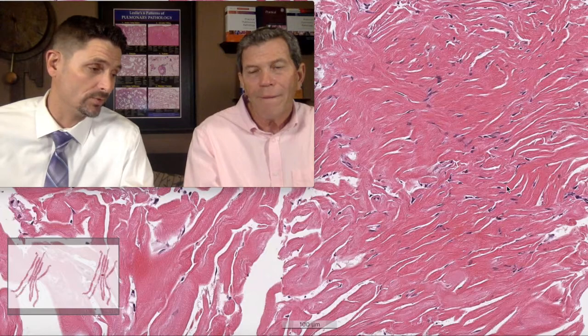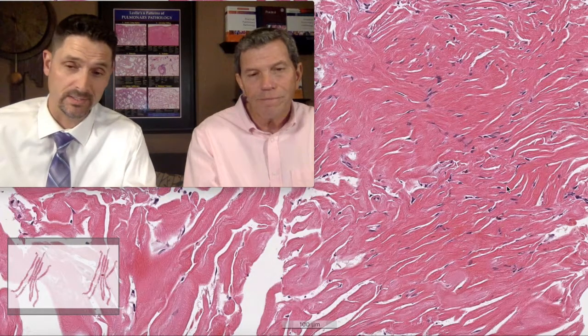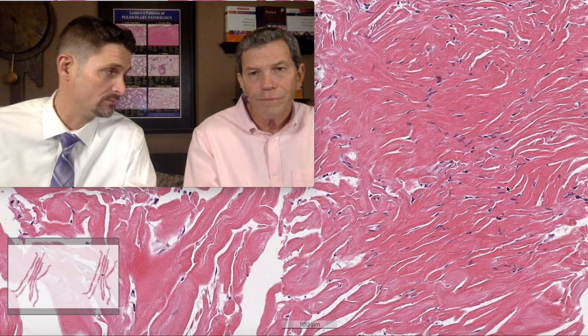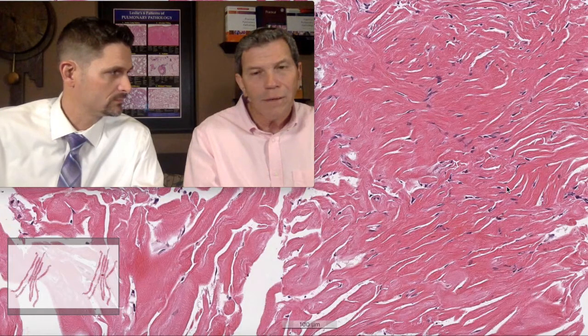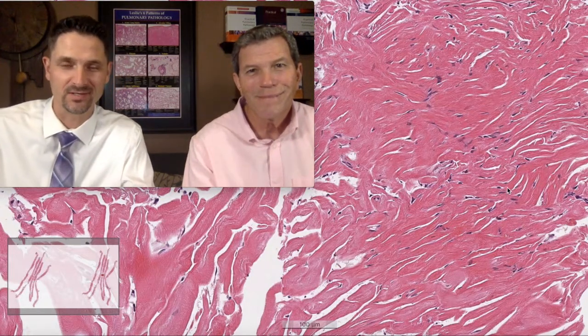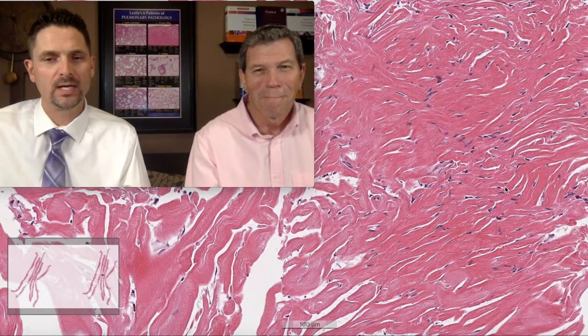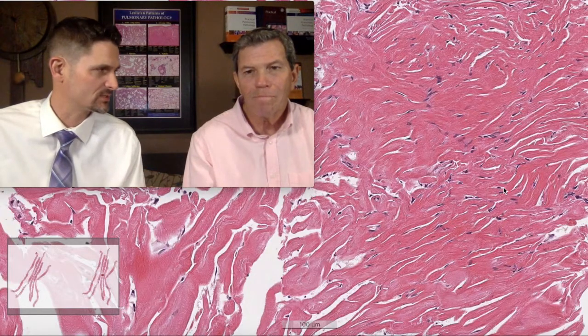I did stains to rule out desmoplastic mesothelioma. They were negative. Keratin negative, WT1 negative, D2-40 negative, calretinin negative. You're such a thorough guy. EMA negative, CAM5.2. Here it is, 9 o'clock at night, and you're still wearing a tie. Still going strong here. So the other thing I got was a STAT6.